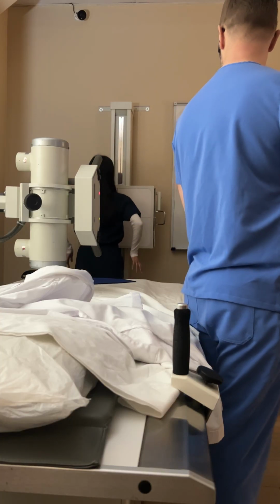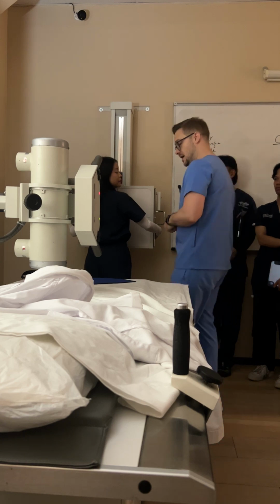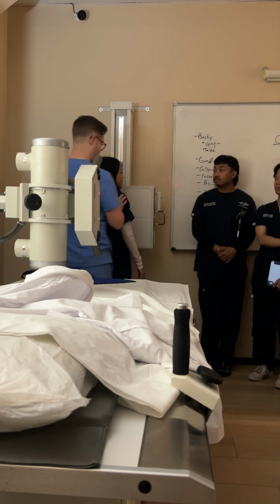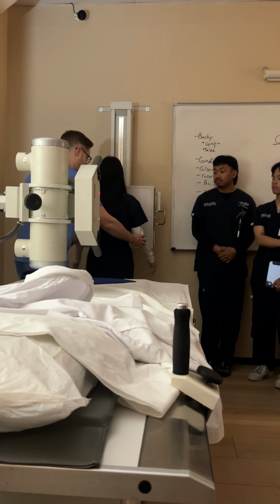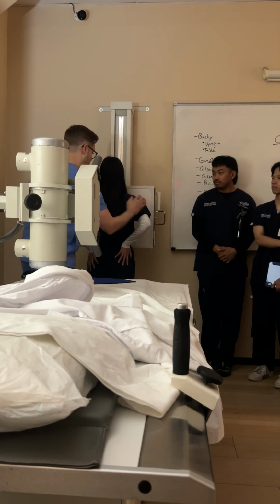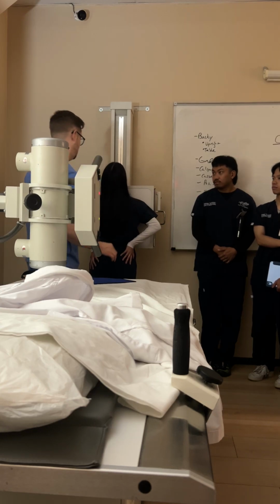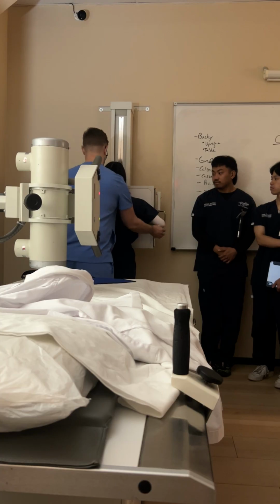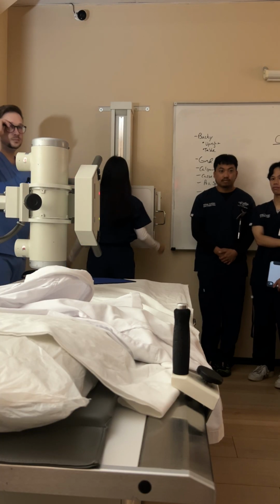So when you put hands on it, can you also put it around? You can. My criticism of that is that the shoulders don't roll as far forward when you do that, okay? So if I have you put the backs of your hands on your hips and then go, those scapulae are now way outside the lung fields. If you just hug it, there's a risk that they could kind of drop back down a little bit, okay? Questions?